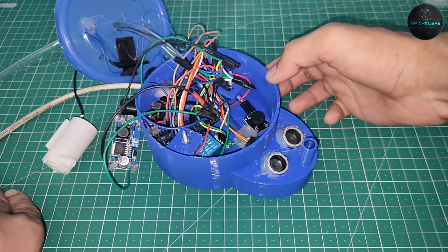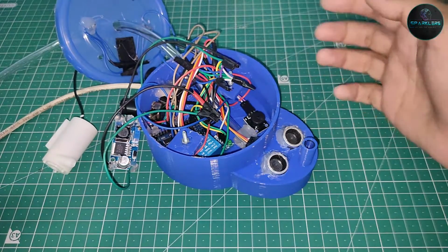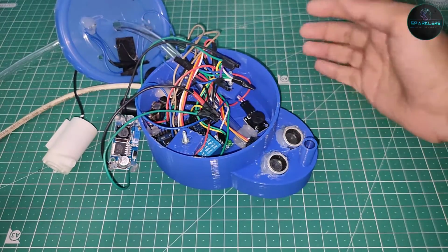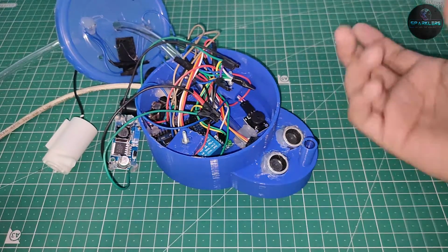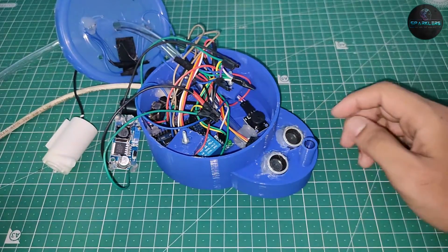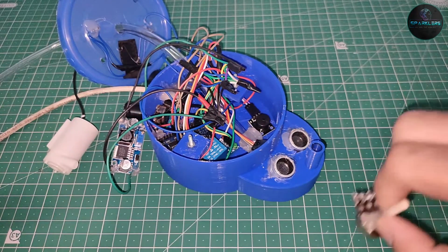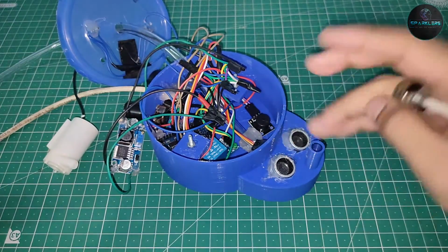And for the buzzer, if it's a 2-pin buzzer, connect the negative with the ground and the positive with Arduino. If it's a 3-pin buzzer, connect the negative with the ground, positive with the 5 volts, and the signal pin to the Arduino. In Arduino you can use the tone library and you can just beep it. It's simple.